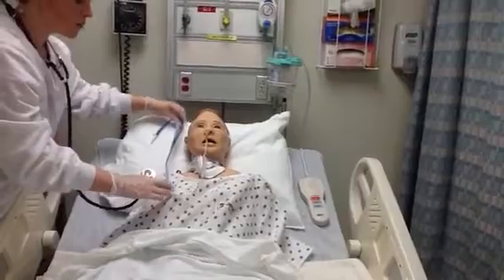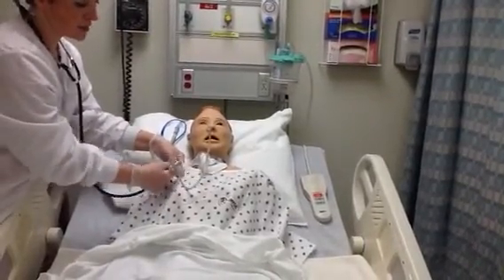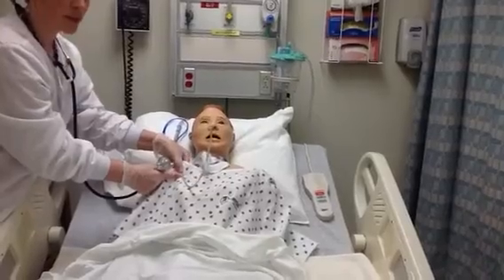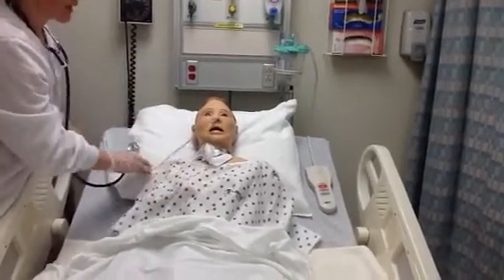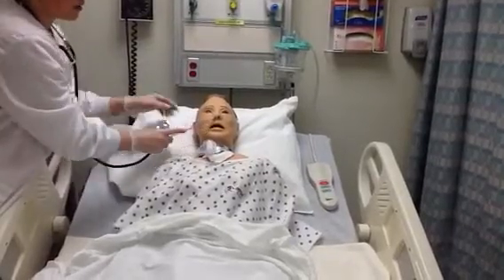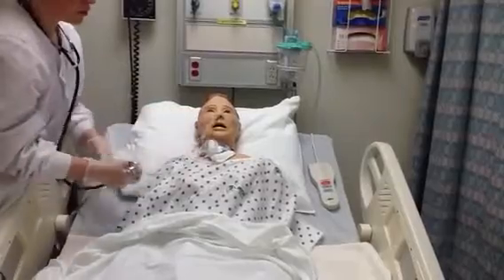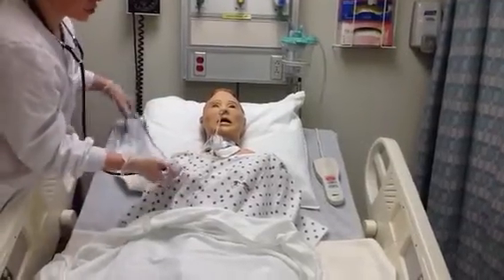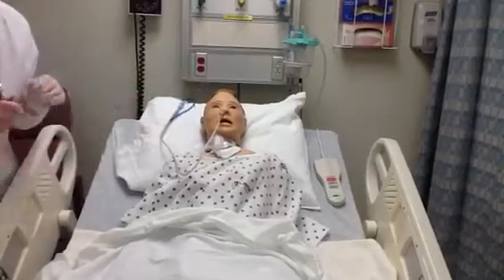You would also want to make sure that your NG tube is connected to the patient gown. You can place a piece of tape around here and then safety pin it to the patient's gown. You don't want it to accidentally get pulled down on the skin, which can then cause breakdown on the nare. So you want to make sure that it's nice and secure to the patient gown. And that is how you would assess a patient who has an NG tube.